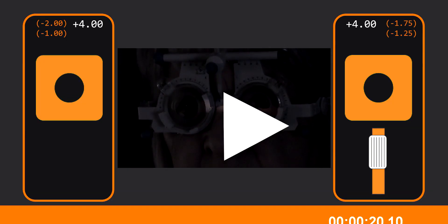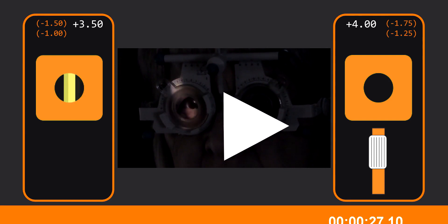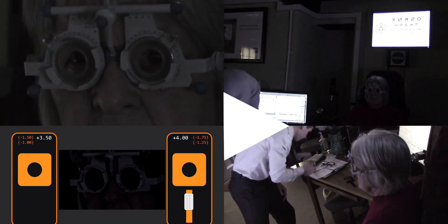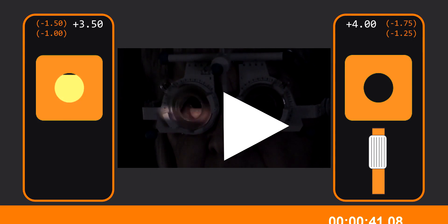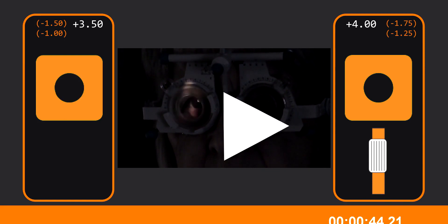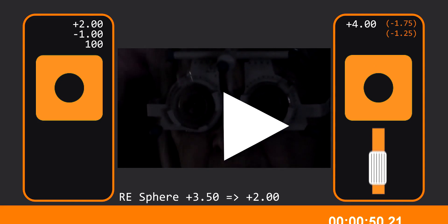Let's continue, remembering that all the reflexes are moving in the opposite direction now. He changes the sphere down to plus 3.50 — now the horizontal sweep is showing neutral. It's time to move on to the cylinder component. He does a quick check of his notes, no doubt to see what the cylinder axis and power was last time. See how he tightens the streak a touch here — this causes the slit to narrow so that he can more easily see the axis of the cylinder. He makes a slow sweep in the vertical meridian, aligning his streak with the reflex that he's seeing.